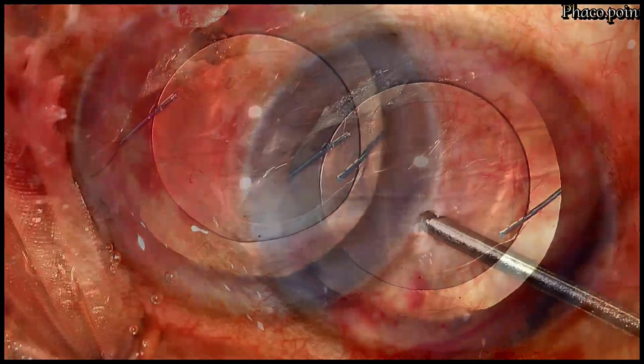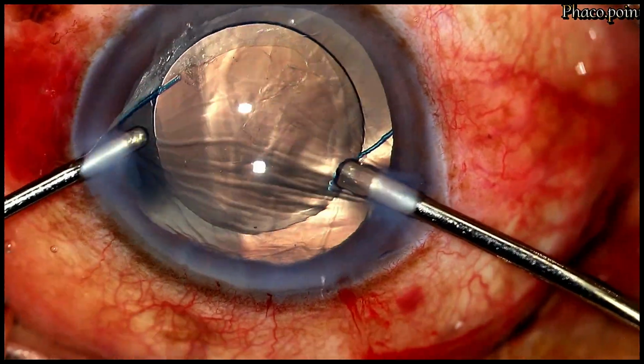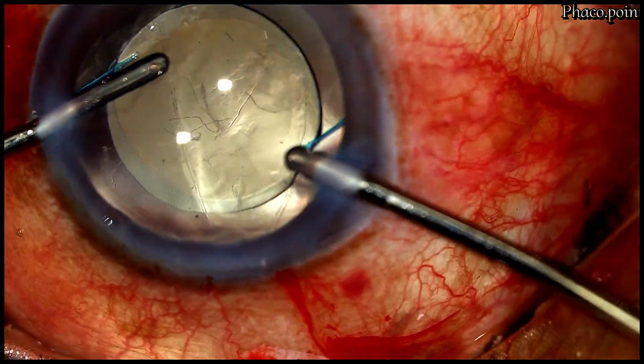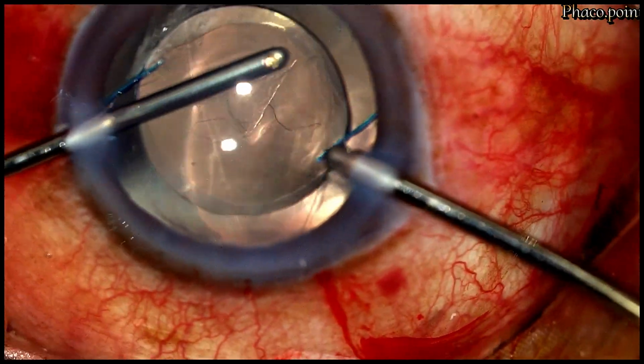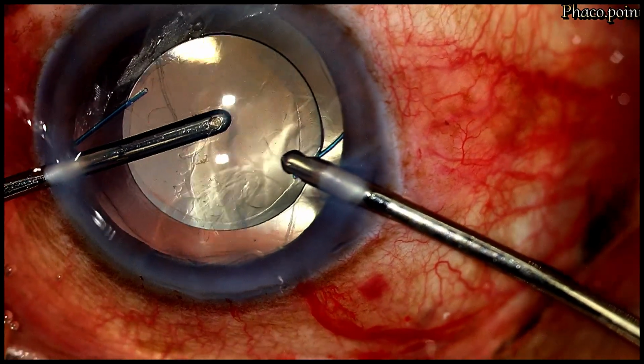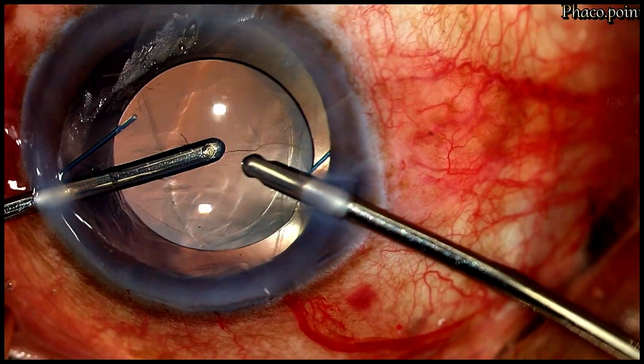Having achieved the desired IOL placement, that is the haptics in the ciliary sulcus, with a posterior optic capture, with care and caution and ensuring that we don't lose the posterior optic capture, the excessive viscoelastic is removed from the anterior chamber.